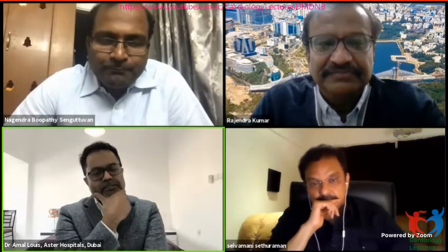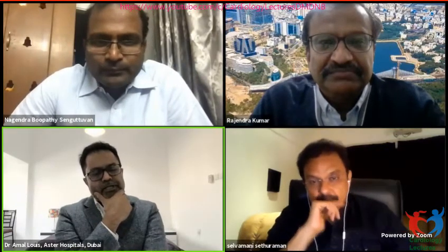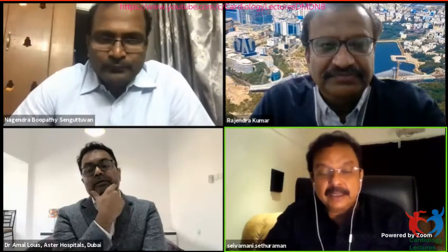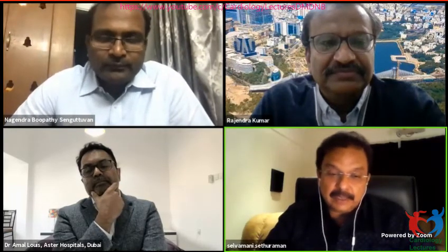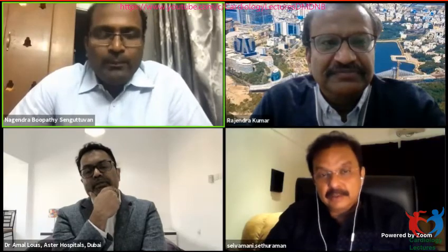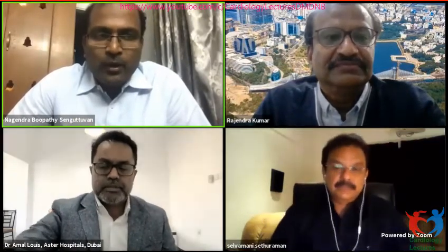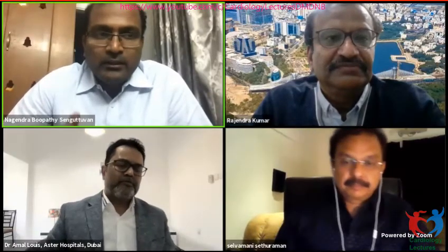What about the other panelists? Any experience with the Impella in India and the approximate cost? Impella in India costs, there are two varieties. One is around 18 lakhs and the other is 22 lakhs. The 2.5 is 18 lakh, and the CP is the other. The 2.5 is the one we use.